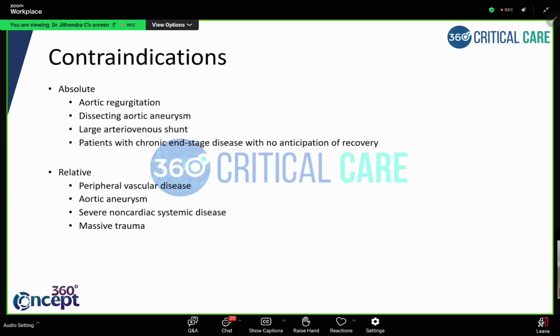Okay. So they may ask you, this patient has a FEMPOP in place or peripheral vascular disease, what do you do? You can try the other vessels. You can try the brachial, you can try the internal iliac. So there are options like that. Okay.